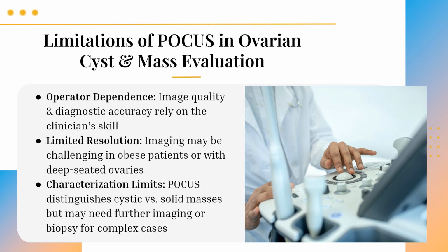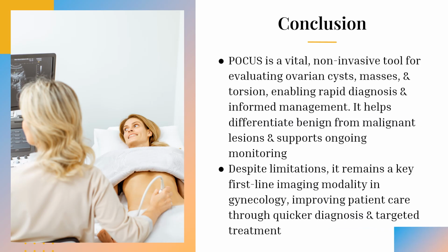Being able to determine between cystic and solid masses is a huge component when you're evaluating cysts, ovaries, and torsions. You have to know: is this benign and can it be followed up with a close eye and conservative management, or is this solid, more prone to malignancy, with concerning symptoms? You need to follow up more closely and quickly.